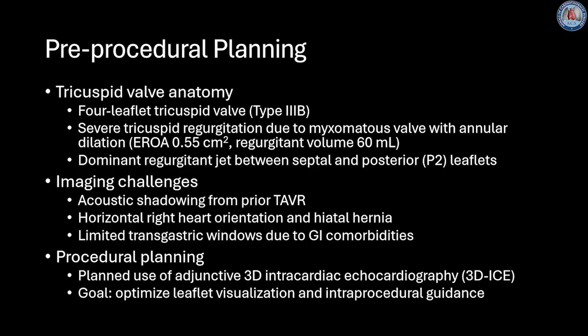Although imaging improved in the distal esophageal window, adjunctive 3-dimensional intracardiac echocardiography, or 3D ICE, was planned for intraprocedural use to optimize leaflet visualization and procedural guidance.